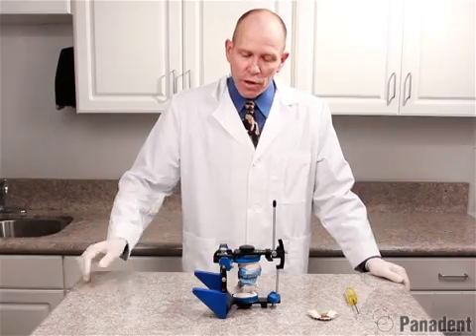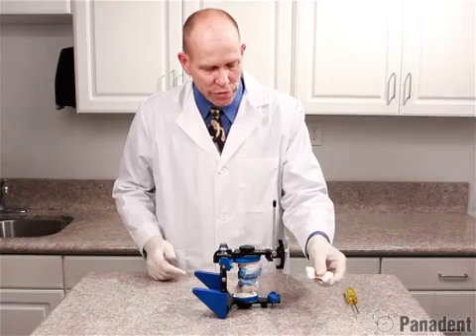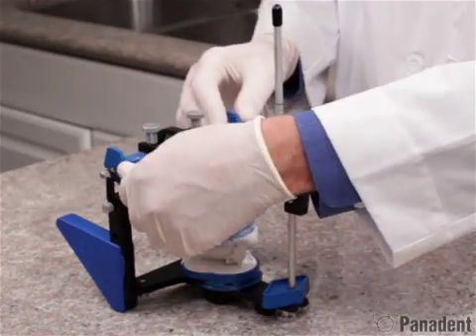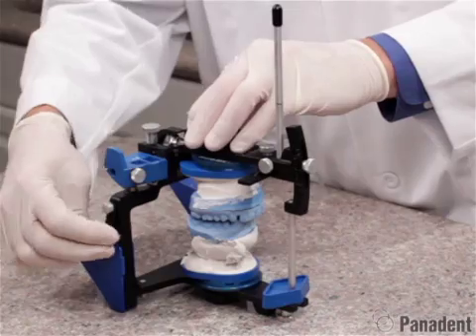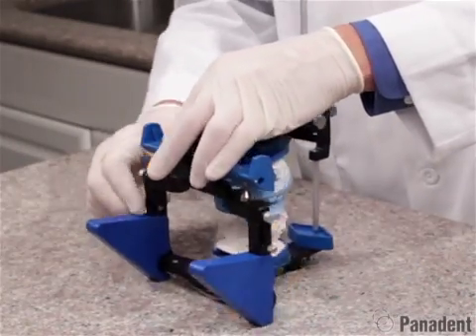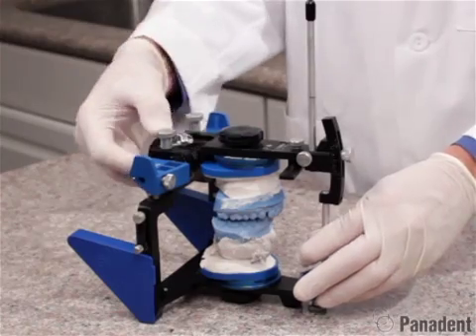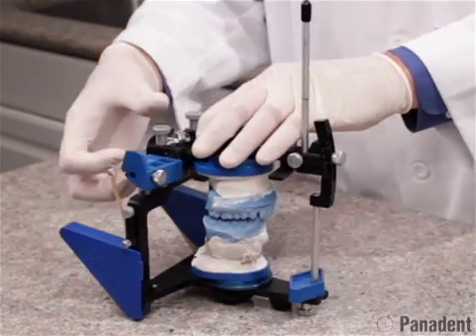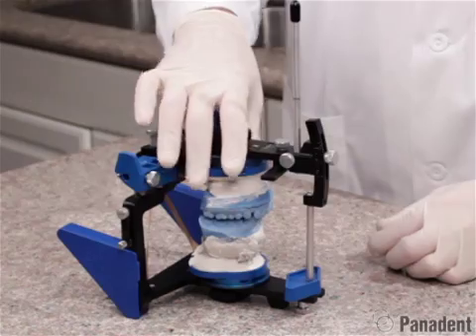We're now ready to set our condylar inclination using our protrusive check bite. In preparation for that, we do want to loosen the screw here on the analog so we can remove our Dynalink pin and put it in its little storage hole in the lower frame of the articulator. We can also release the centric latch and use the rubber band on the bottom of the articulator to help hold that latch out of our way.